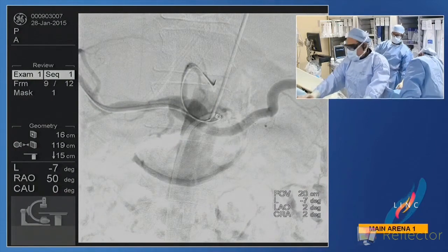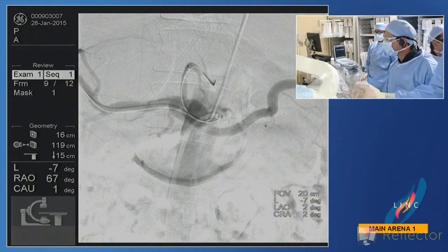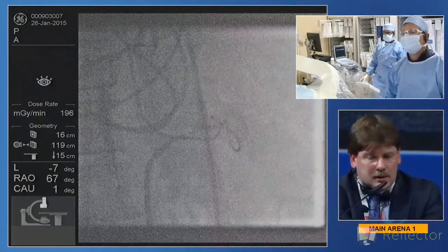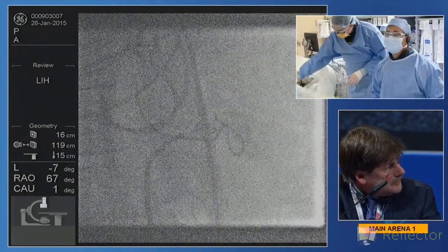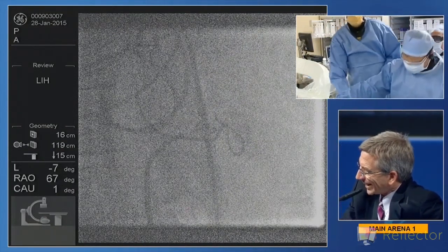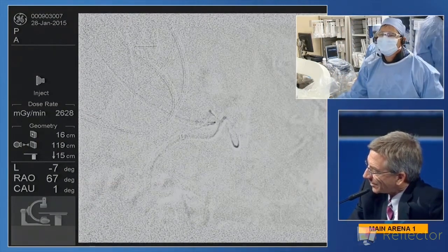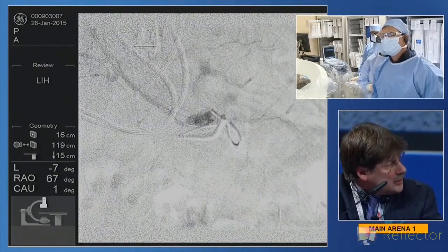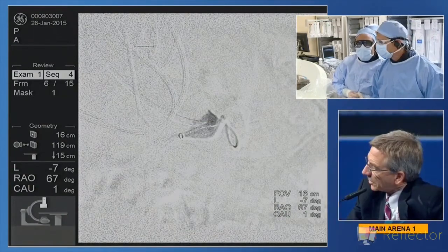Peter, this was a strategy you were alluding to earlier, a balloon expandable stent to either reinforce the ostium? I think you could do it with a self-expanding nitinol stent. But the problem is the lengths. We don't have short lengths with reliable endpoints. So this is where a balloon expandable is helpful. Does it need to be an iCast if you've already used a Viabahn? Does it need to be a covered stent? Can you use a renal stent inside there, since you've already got a Viabahn in there? I think you could.